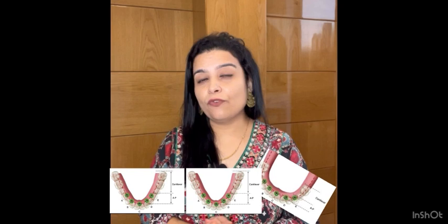But if the patient's force factors are high, if they parafunction, if they have a low bone density, if you cannot cover all the key implant positions in these patients, if the opposing dentition is an implant supported fixed prosthesis or a sound natural dentition, then in these cases you have to reduce or eliminate the cantilever length. You have to increase the implant number, you have to increase the implant size, you have to increase the implant design surface areas to be able to support the prosthesis.